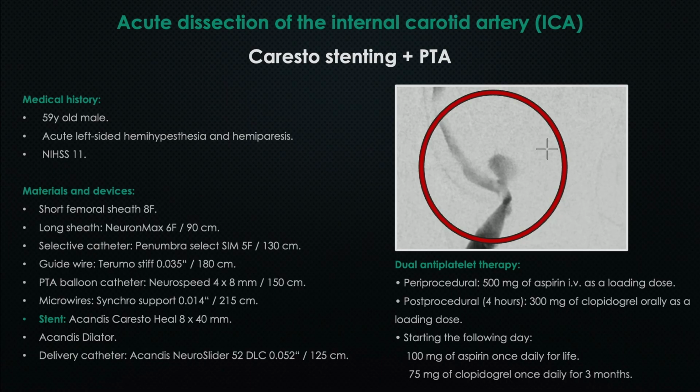It was a spontaneous dissection of the distal parts of the internal carotid artery, and for the treatment, we've used a Carotid stent 8 by 40 millimeters with an antithrombogenic coating, and this stent is very flexible.